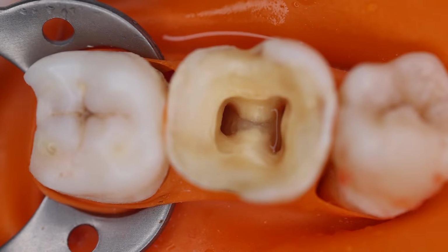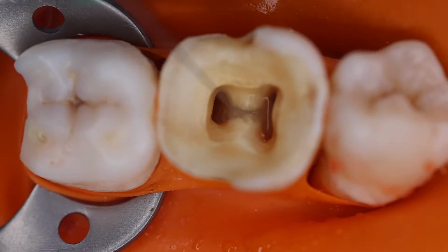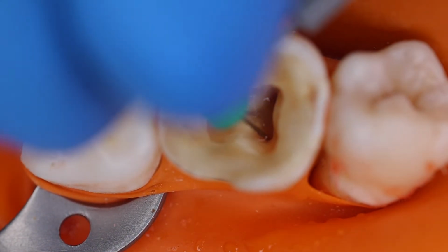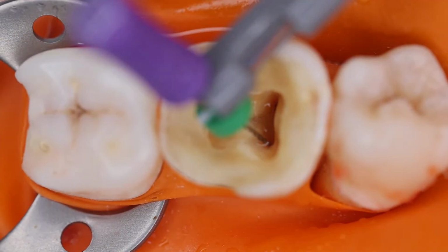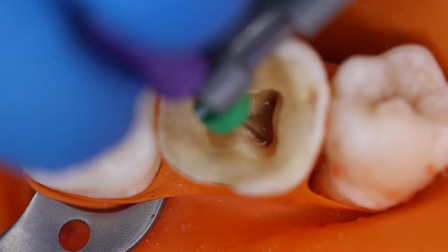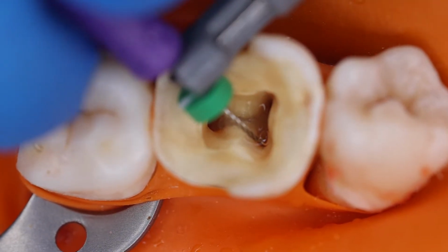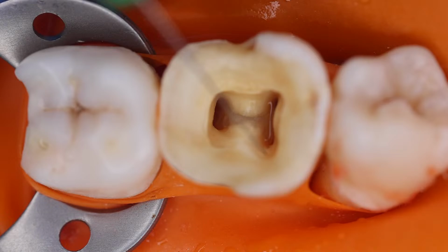Then measuring the length of the mesobuccal canal orifice. With this reference point, the stopper lying at the distal orifice, it is coming out to be 19 mm again.